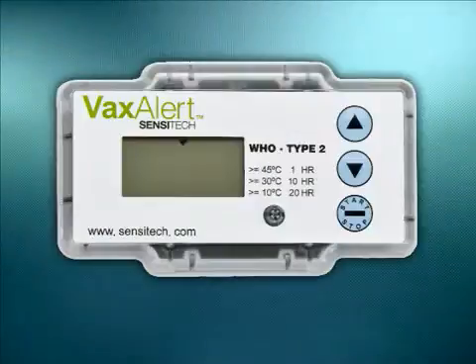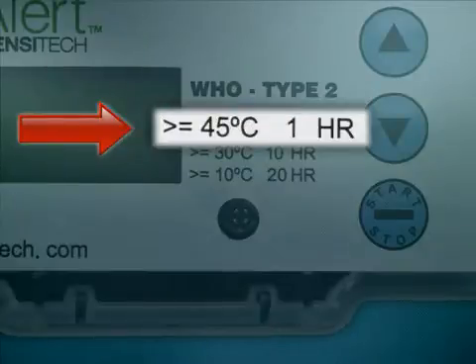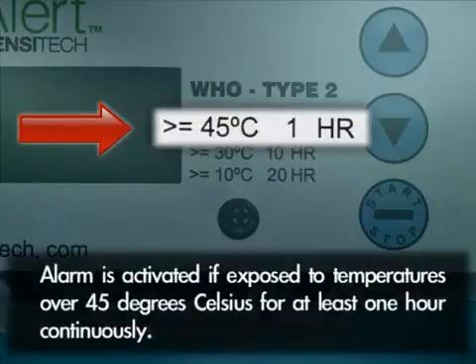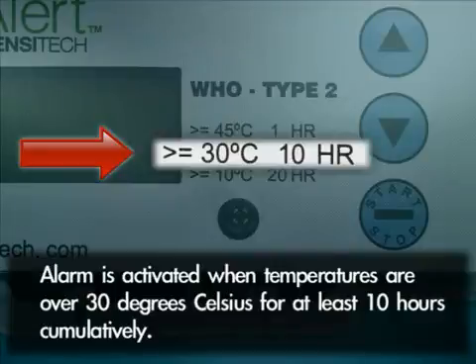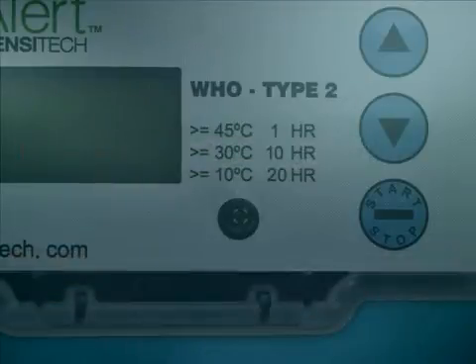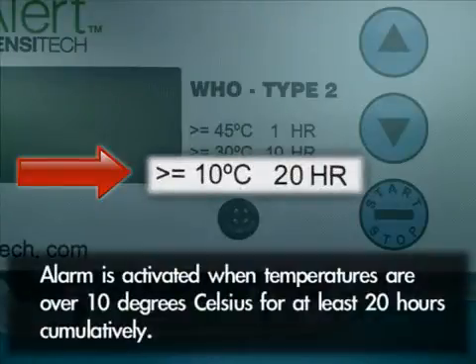In the Type 2 device, the 45 degrees Celsius alarm is a single alarm for 1 hour or more. This alarm is only activated if the package is exposed to temperatures over 45 degrees Celsius for at least 1 hour continuously. The 30 degrees Celsius alarm is activated when temperatures are above 30 degrees Celsius for at least 10 hours cumulatively. The third alarm is the 10 degrees Celsius alarm that is set to trigger if exposed to temperatures greater than 10 degrees Celsius for at least 20 hours cumulatively.